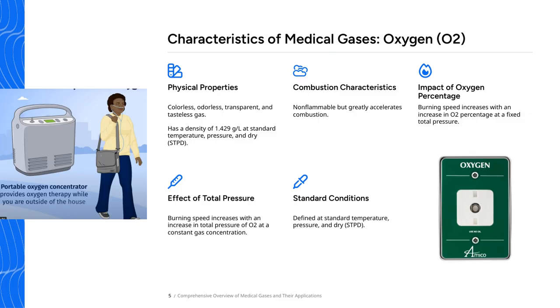However, it can significantly accelerate combustion, meaning it makes fires burn more intensely or quickly, even though it doesn't catch fire on its own. This is a vital safety consideration in medical settings.